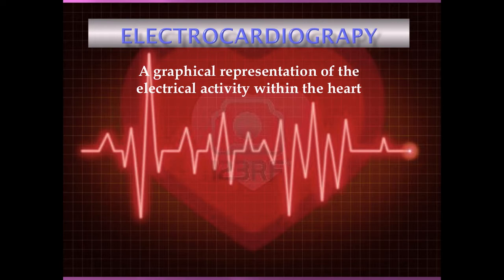Anyway, here we go. As an exercise physiologist, we're required to have a proficient ability to interpret the information given to us from an ECG machine. We'll use ECGs on patients or subjects to check the current status of their heart, if they're at high risk for cardiovascular disease, have had symptoms of a heart attack, previously had a heart attack, or want to participate in certain maximal exercise tests.